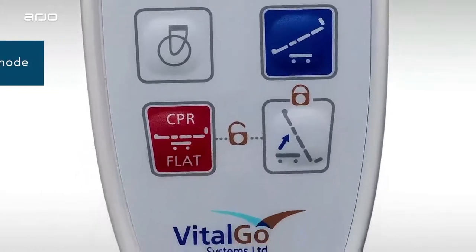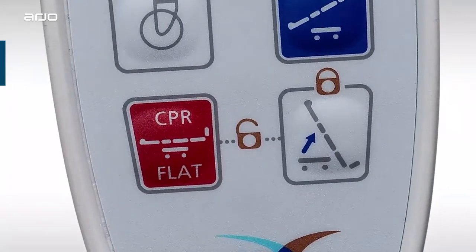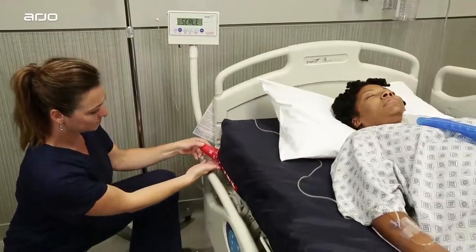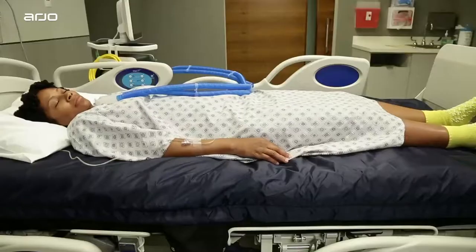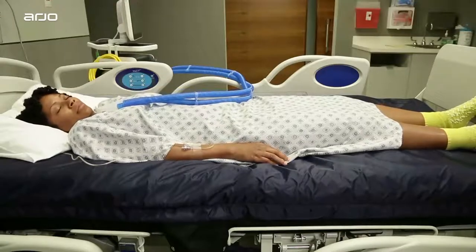These buttons raise and lower the entire bed. The CPR flat button immediately lowers the bed to perform this emergency procedure. To perform CPR, you will also need to deflate the mattress by turning the red CPR valve until the arrow aligns to the open marker, which allows air to escape quickly.